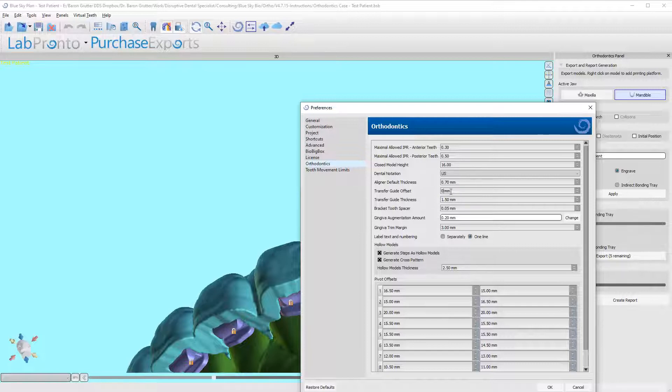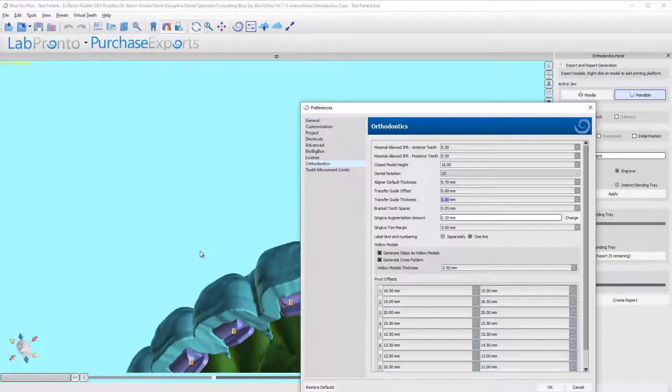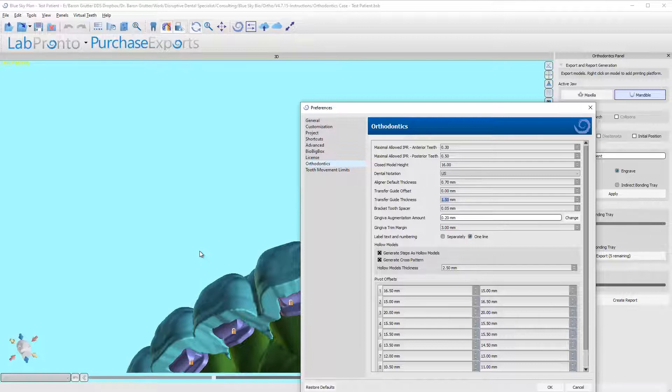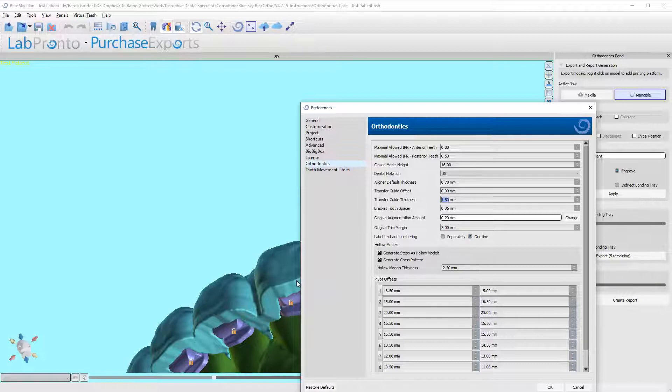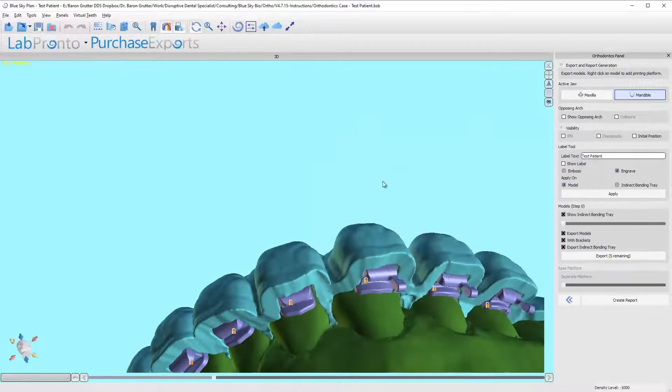I'm actually gonna argue that you could probably go down to 0.0. Reason being is these trays are going to be a flexible material. If you're printing a rigid material like a surgical guide material, you're gonna need that space. You're gonna put some ortho wax in the tray and then you're going to seat the bracket that way. But if you're gonna be using a flexible material, you want to grip as intimately as possible.